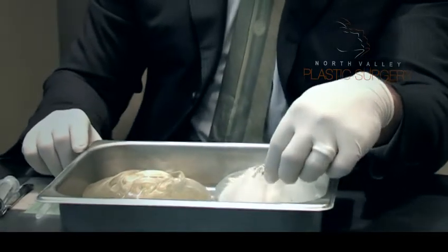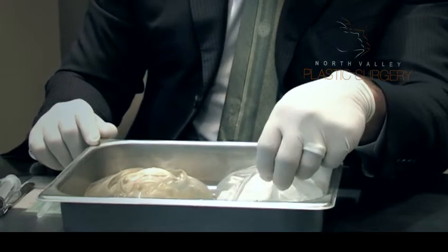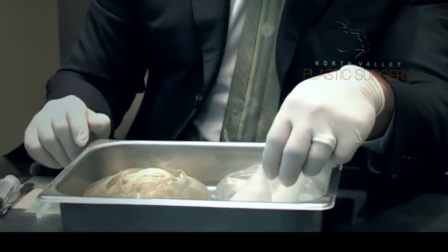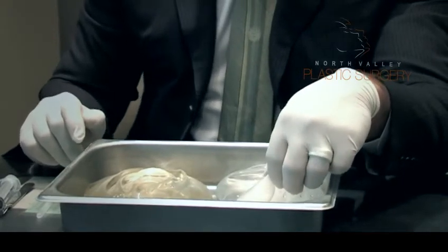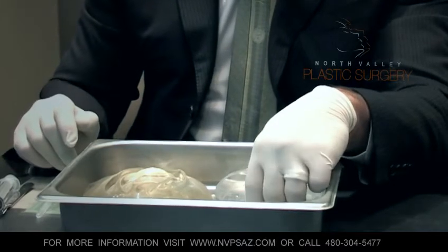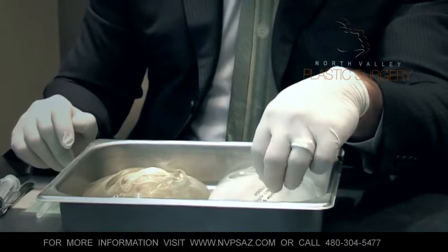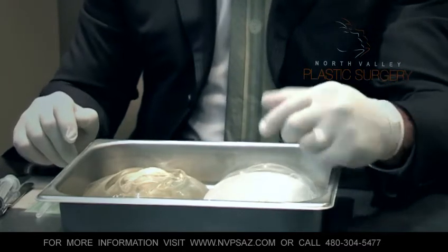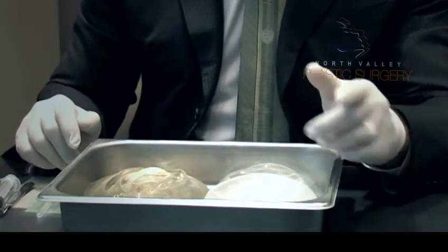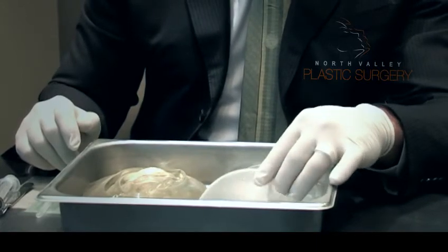And what do we do with a leaking implant? Well, we take it out and in most cases exchange it for a new implant. Many patients will want to go to a silicone gel breast implant at that time or stick with a saline implant. The two major implant manufacturers, Mentor Corporation and Allergan, both offer very nice warranty programs with their implants so that in the event of rupture, for a specified period of time, usually about 10 years, the manufacturer will supply a new implant free of charge, and for a finite period of time, they'll put forth some money towards your secondary surgery to replace the implants.